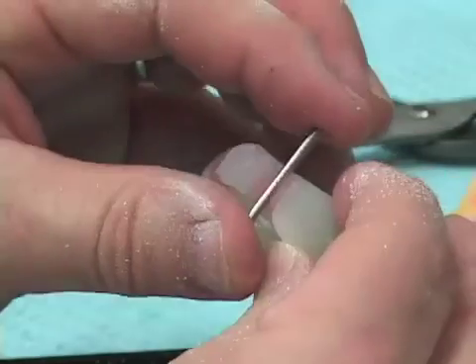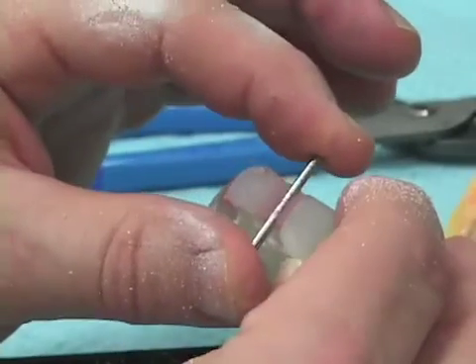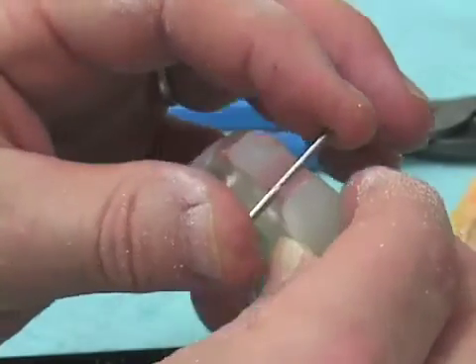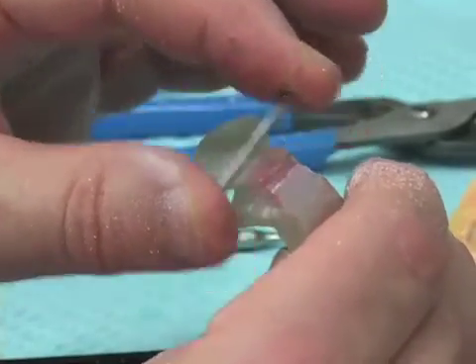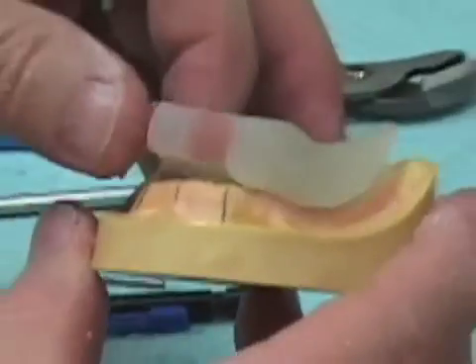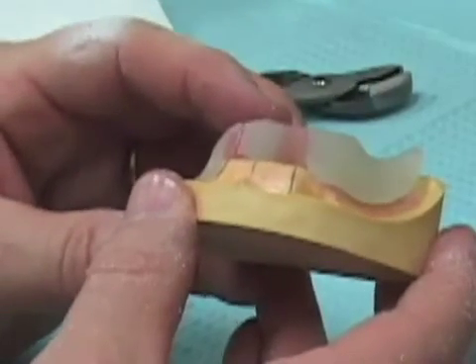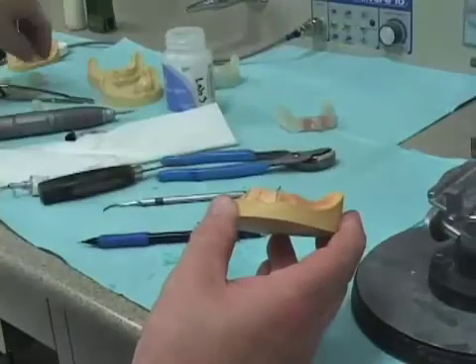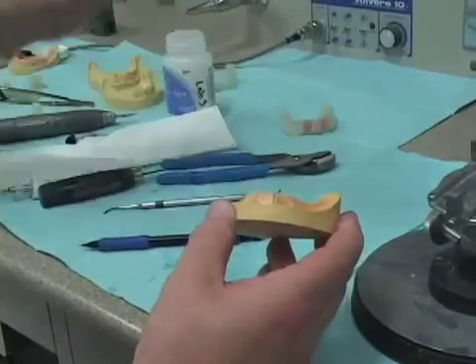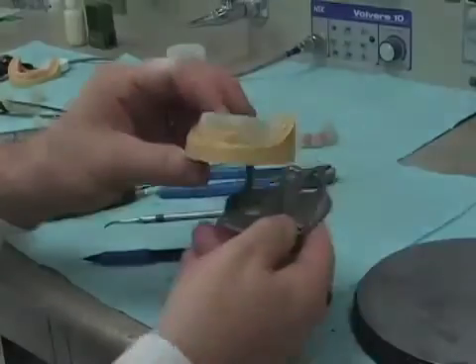So on both sides, it freely passes in and out from the buccal or labial, and there's no lateral twisting. So that completes the surgical guide for the 2.2 millimeter twist drill. Now I would follow exactly the same procedure for making the surgical guide for the 2.8 millimeter twist drill.